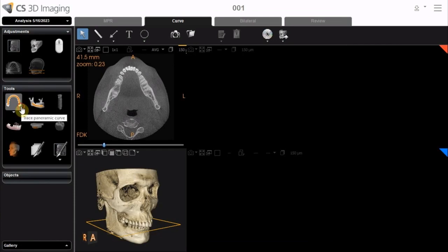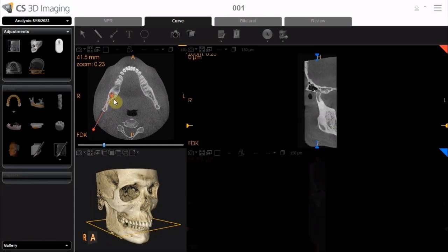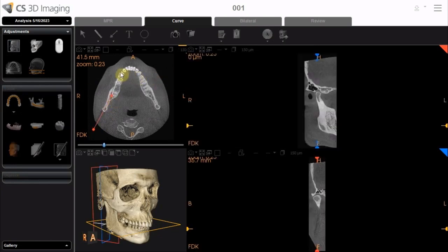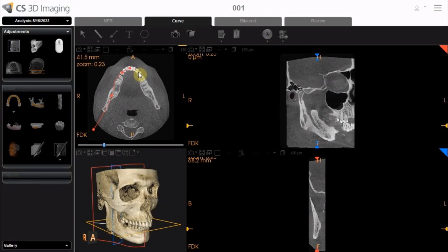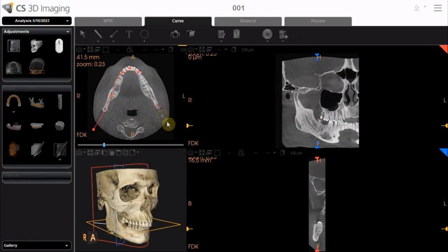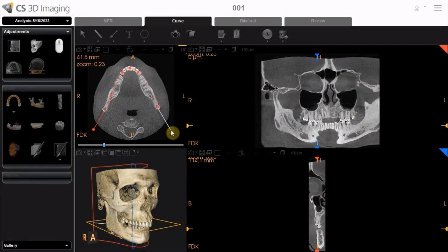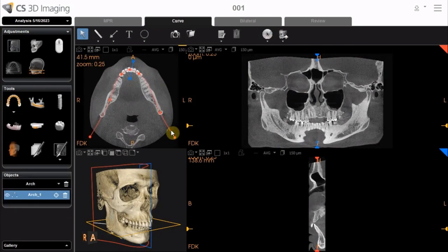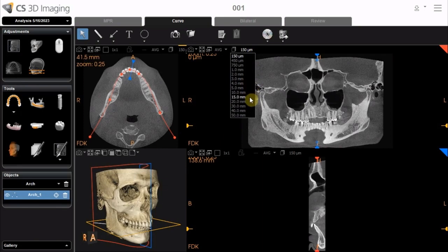To create the arch yourself, activate the Manual Tracing tool. Click to select control points along the arch — seven control points are recommended. To finish the Dental Arch, double-click to set the last control point of the trace. The trace is complete and an entry is created in the Object List. Then, select a value of 10 to 20 mm to display the reconstructed panoramic view.